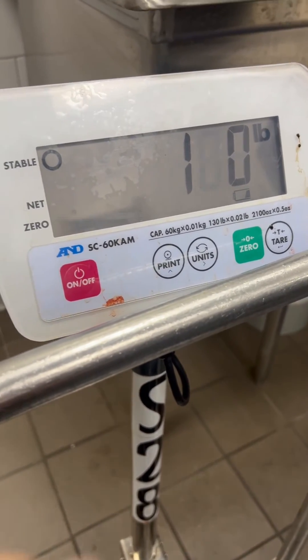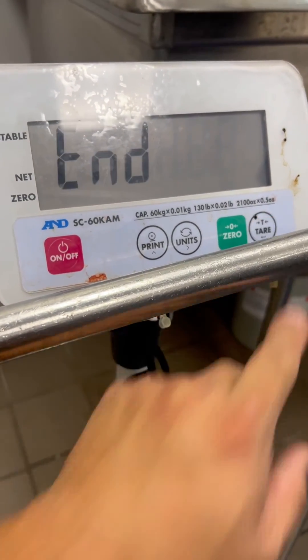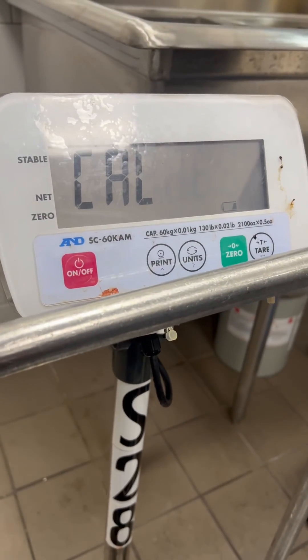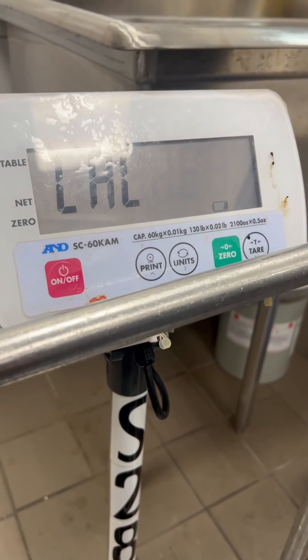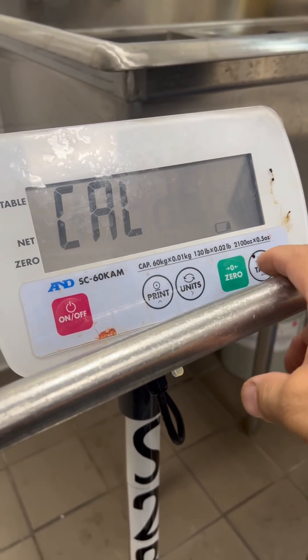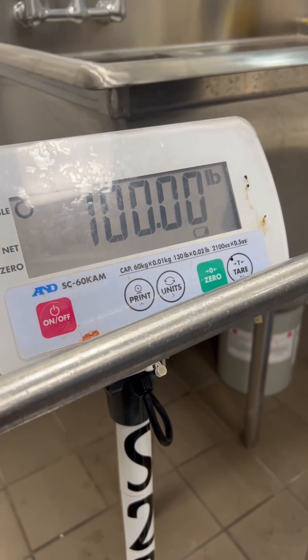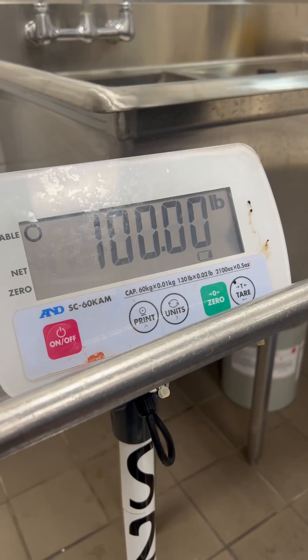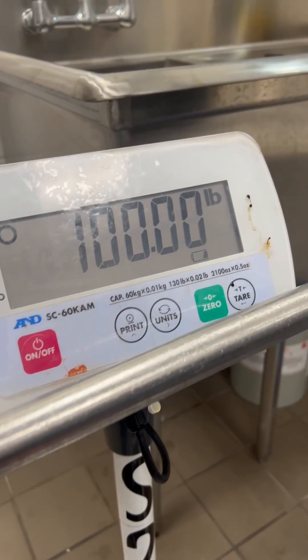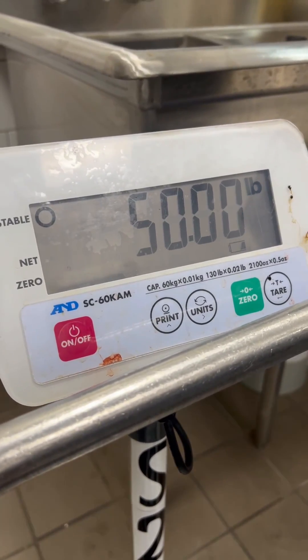Once you apply your weight and hit enter, press enter again to exit to weighing mode. And that is pretty much how you adjust the calibration operation of an A&D SC series.